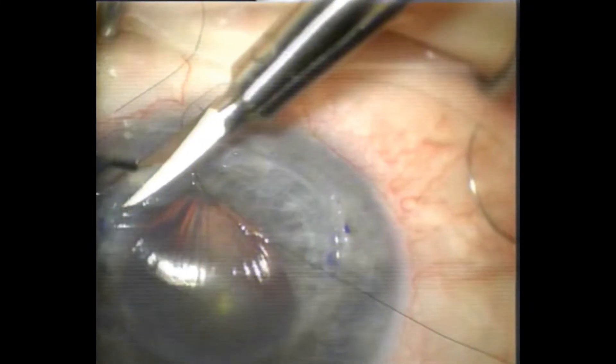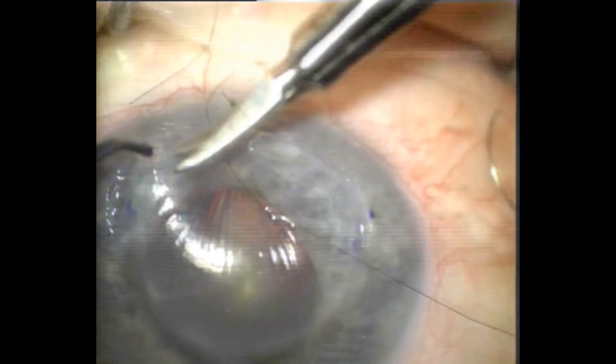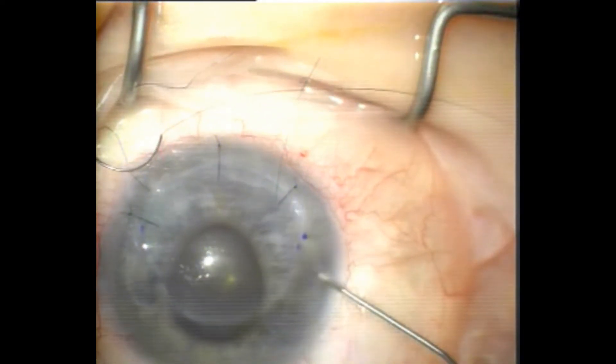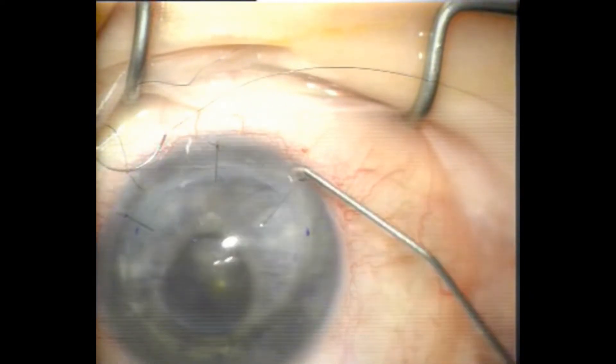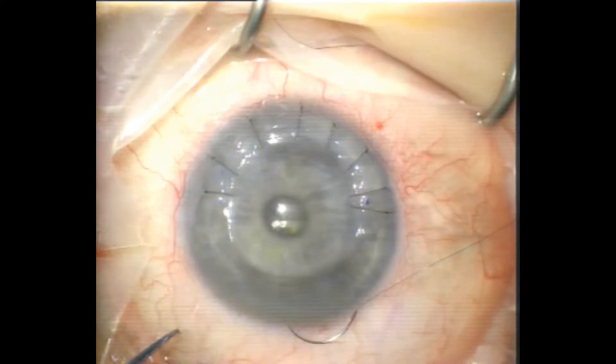Just trimming the edge of the donor side there where there's some hypertrophic scarring. And now placing some Miochol into the AC. Inflating the AC and the stitch is broken. After 7 or 8 sutures are in, just checking with the surgical keratometer — it's a little bit triangular but not too bad. You can see the 6 o'clock is a bit loose there.